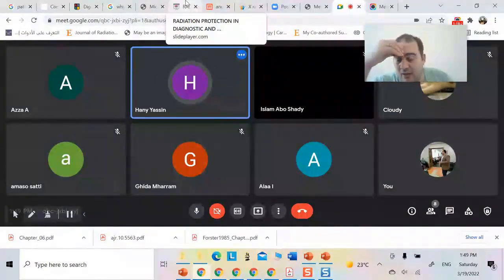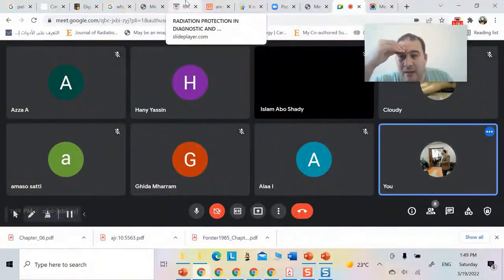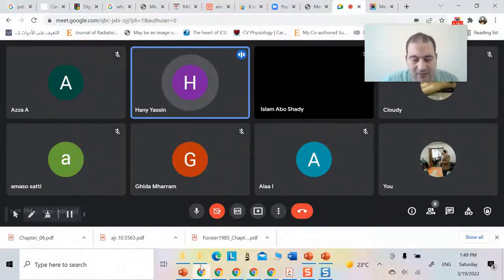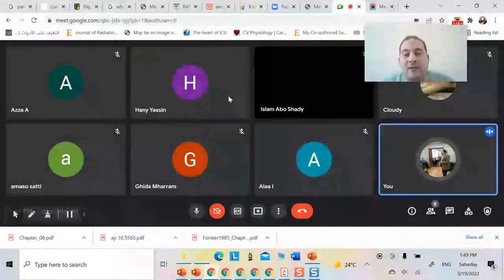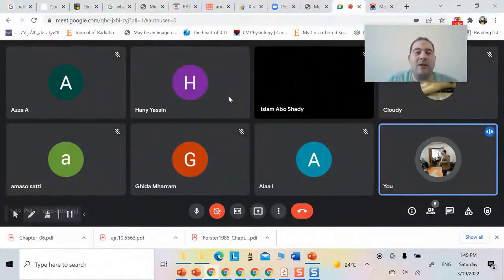Does the bit depth reach a number of 12? Yes, it reaches 12, but this is in mammography. I want to confirm the value that you find present. Can it display all these details? No, of course. You won't be able to display everything, because there are limitations with the display monitor, but you can display the maximum possible number of pixels. That's why mammography images are displayed on screens specifically designed for mammography. The specifications of these screens will tell you the resolution in megapixels, and you will find that the number is very high and the size is large.